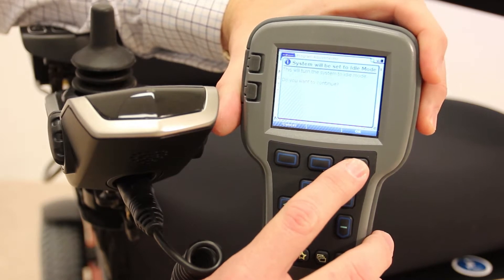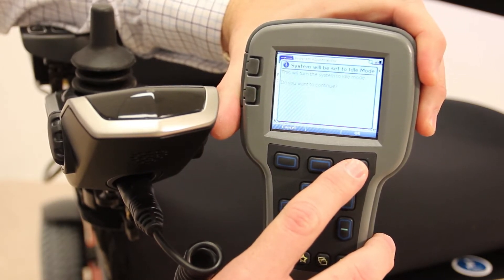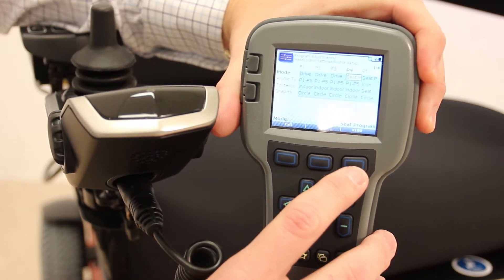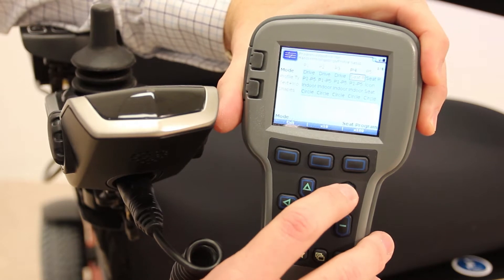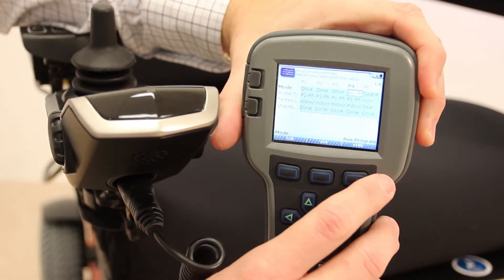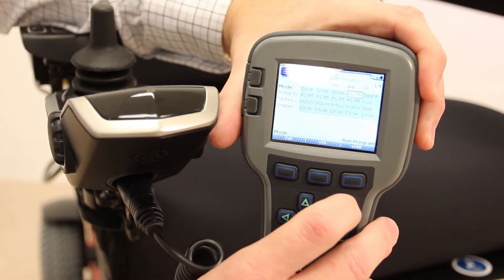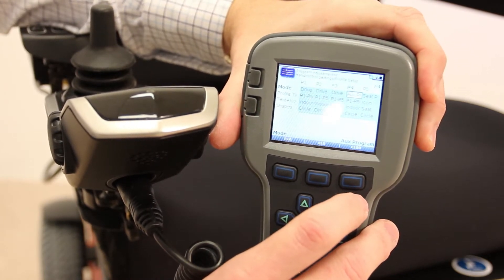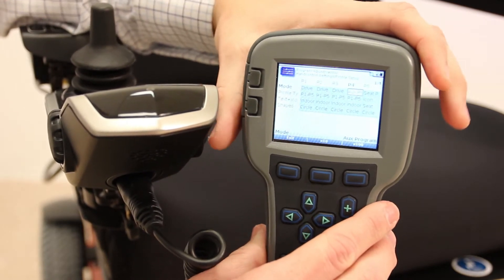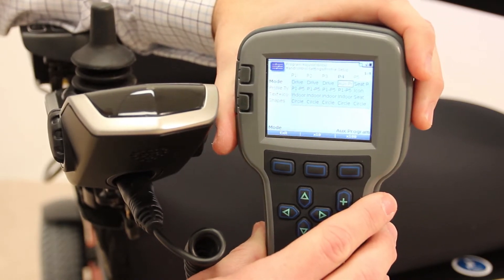Any time you're making a major change to the system, you need to go into idle mode so that the person cannot be driving while the change is being made. We're going to hit the plus key until we see profile 4 change to aux profile — that's auxiliary profile — and the steps are completed. We now need to cycle the power to the power chair off and then back on in order to resume use of the chair.